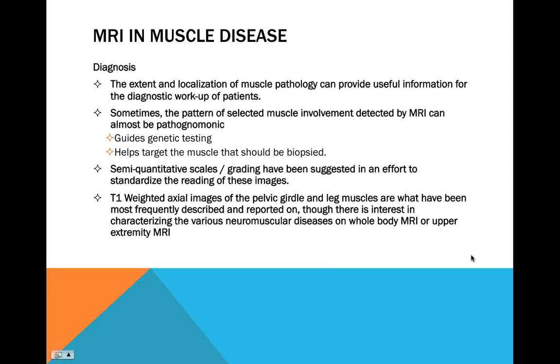So on whole body, you get the added benefit of getting some of the paraspinal muscles, or the muscles that support the spine. You can also get some of the neck muscles and the shoulder muscles, and you would expect that you can get a good view of the arms, but it's actually not the case. Oftentimes the arms are way too far out and you lose the image in the periphery. So you can only get parts of the arm inside there. Even if you sandbag the arms close to the body, it doesn't work. And then you would think, well, maybe you could put the arms on top of the body. Well, because you're breathing during the study, there's motion artifact from that, and you still can't get good images of the muscle. So that's a really difficult thing.